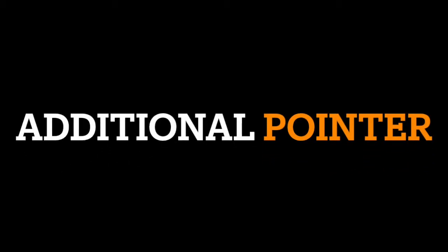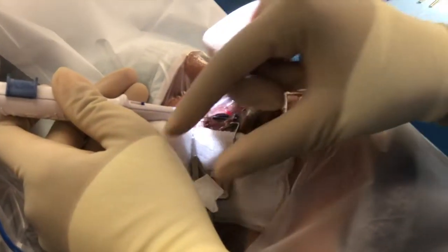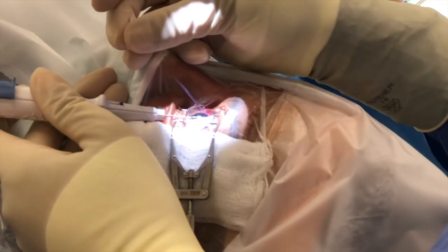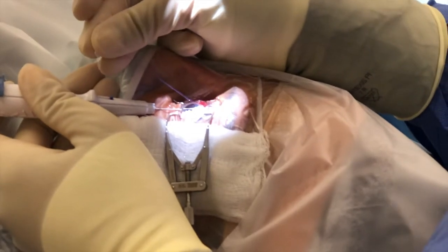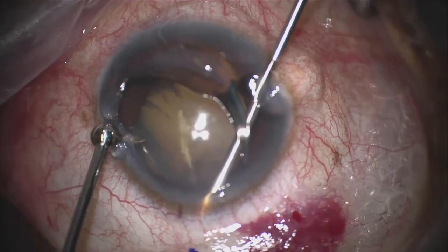An additional point to help with this technique is that I like to use a sticker to tie the suture together for easy manipulation when the time is ready to infraduct and pull the eye down. I recommend still making a paracentesis for the Vera hook just in case the suture slips at that moment when you really need to use it.